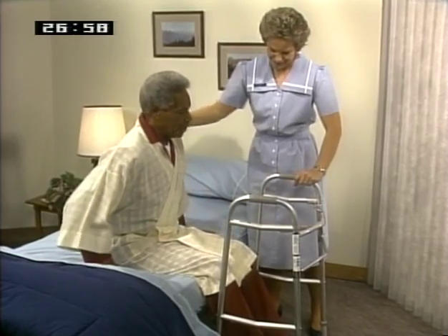Check on the comfort of your patient. Document use of the walker, distance ambulated, how the patient tolerated the ambulation, and other important observations. Be sure to contact your nursing supervisor if the patient shows any signs of intolerance or experiences any unusual symptoms.